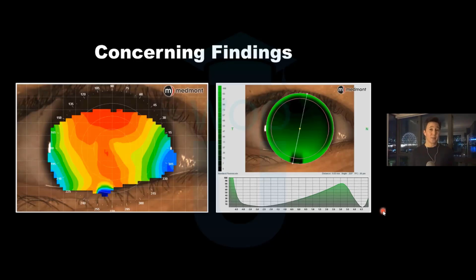And I can't emphasize enough to you how important it is to spend the time on these baseline topographies. You know, oftentimes you're pushed for time, but this is one where you really want to spend as much time, be exhaustive about this phase, because good data going into WAVE creates good data coming out of WAVE.